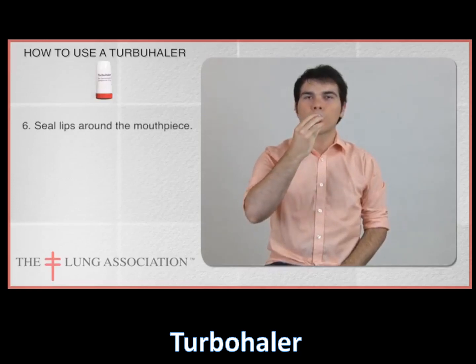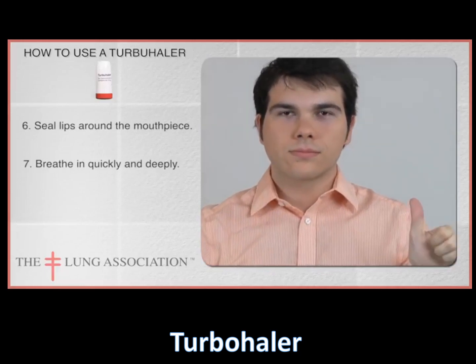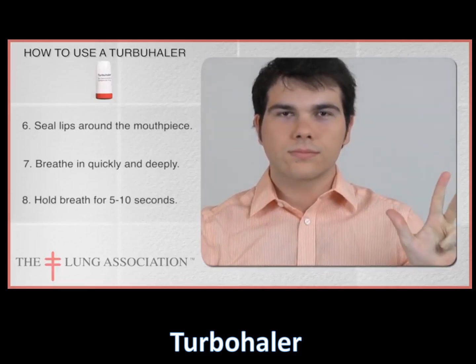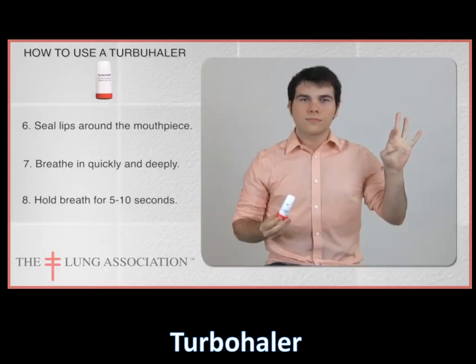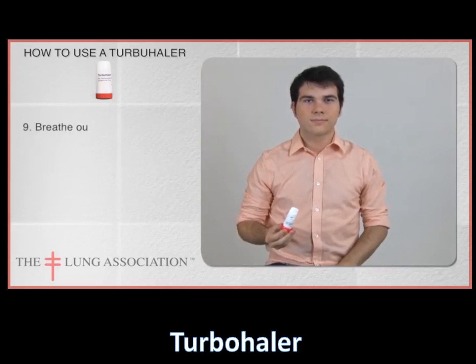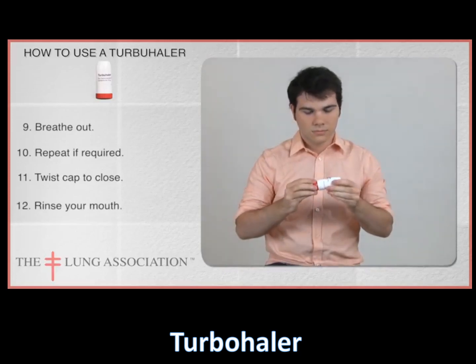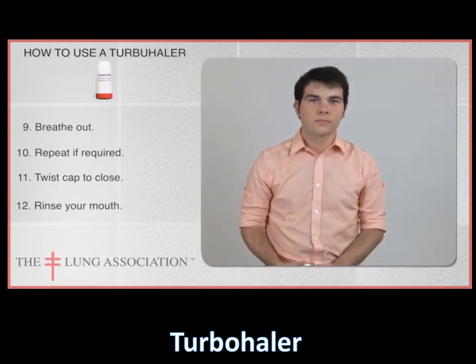Seal your lips around the mouthpiece and breathe in quickly and deeply. Hold your breath for 5 to 10 seconds. Then breathe out. If you need a second puff, repeat these steps. When you're finished, place the cap on, twist to close, and then rinse your mouth.